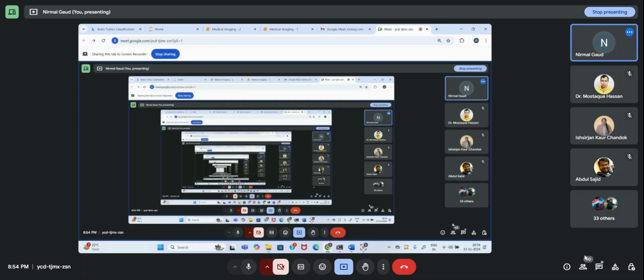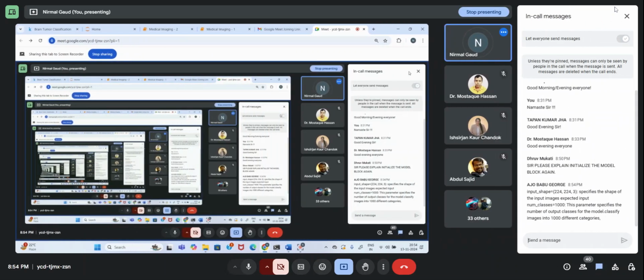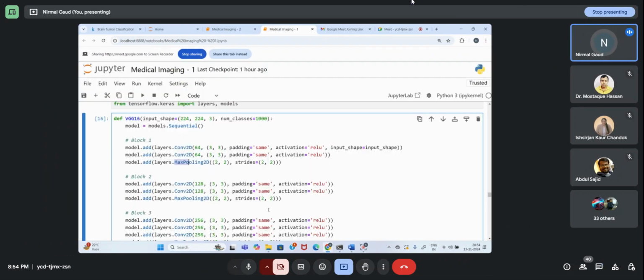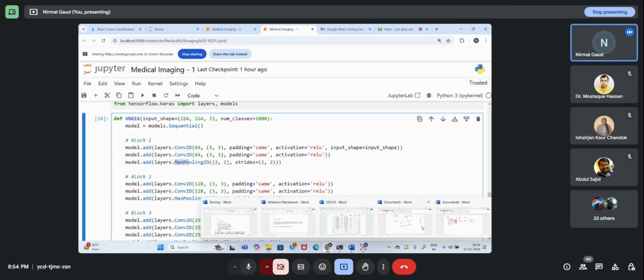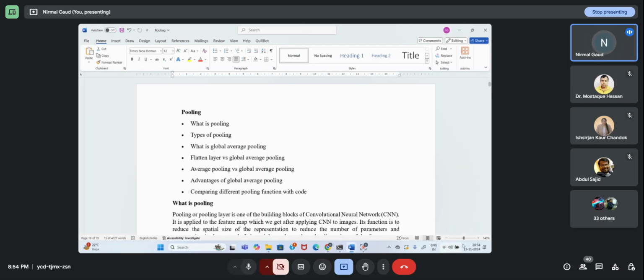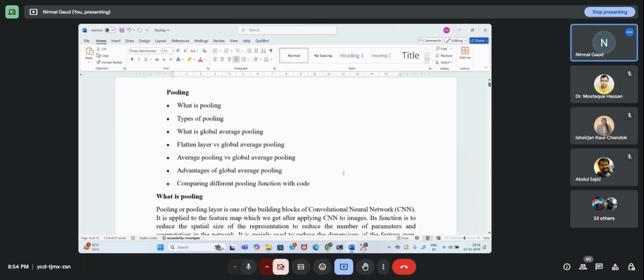Okay, got it. Fine. And then the shape, I will explain ahead. So I'm going to get such values from the max pooling. I need to explain more about this pooling technique because we have different types of pooling available. You can see it in my tutorials related to pooling.